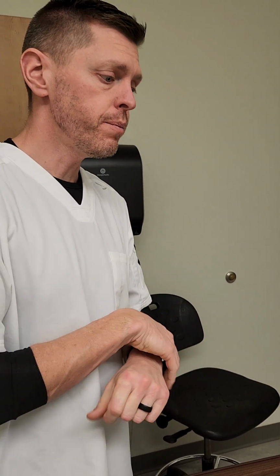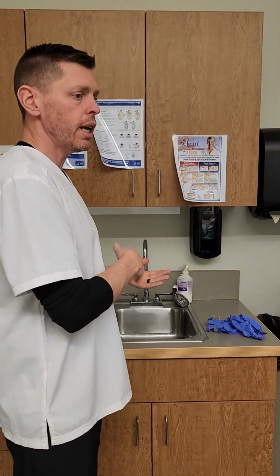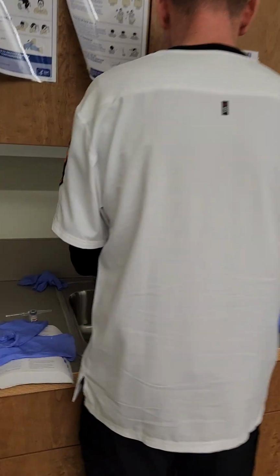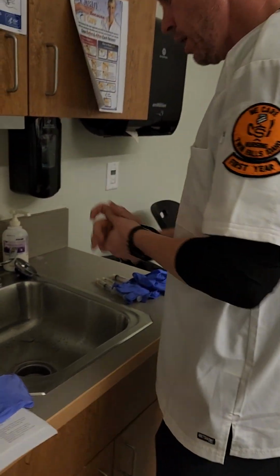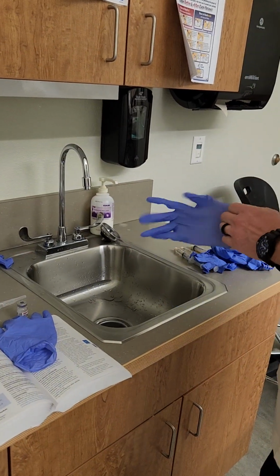So I'm going to go get it, and then I'll be documenting as well. So anyway, I'm going to go do hand hygiene, get the medication, and I'll be back with all my supplies. All right. Wash my hands, sanitize. I'm going to go ahead and put on some gloves just because.